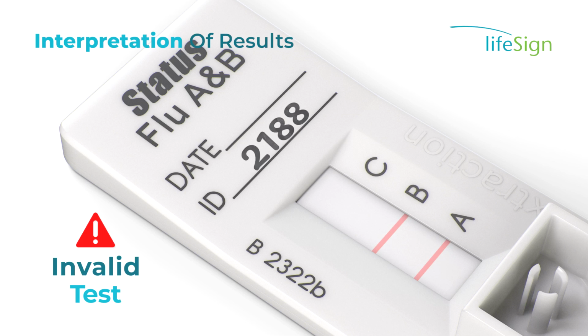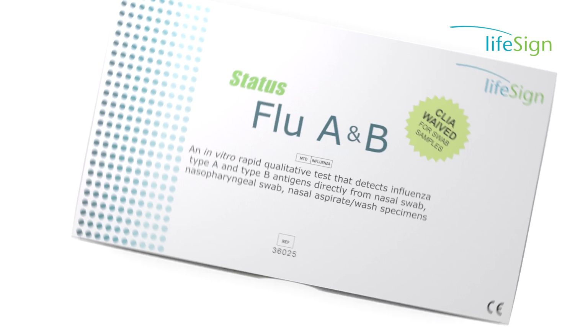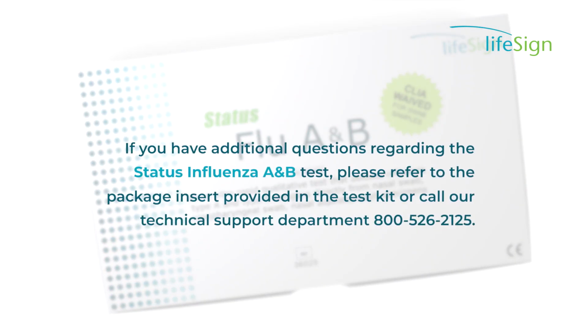Once the test is completed and patient results have been recorded, dispose of all testing material used in the appropriate waste container according to your state and local biohazard waste disposal guidelines. If you have additional questions regarding the Status influenza A and B test, please refer to the package insert provided in the test kit or call our technical support department at 800-526-2125.